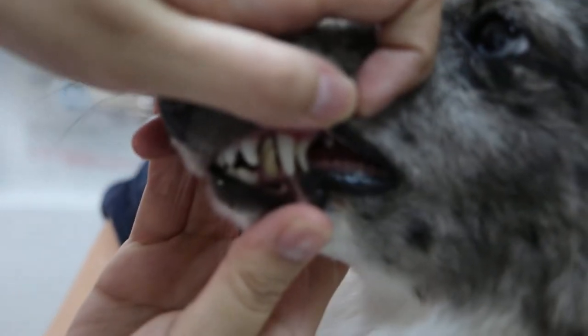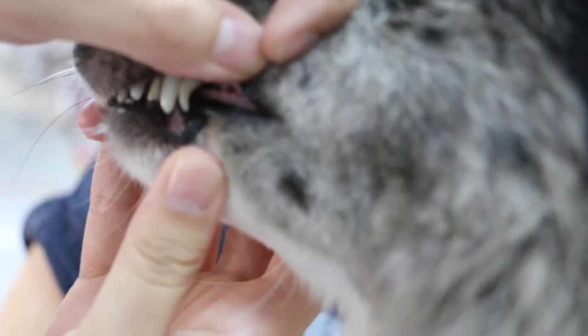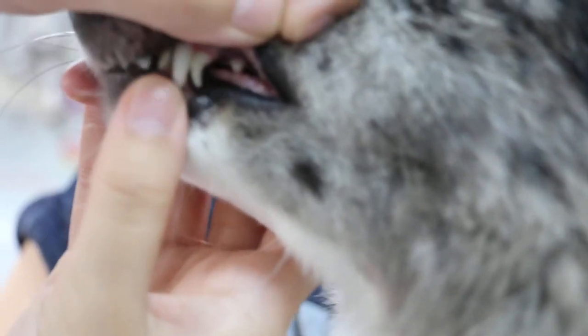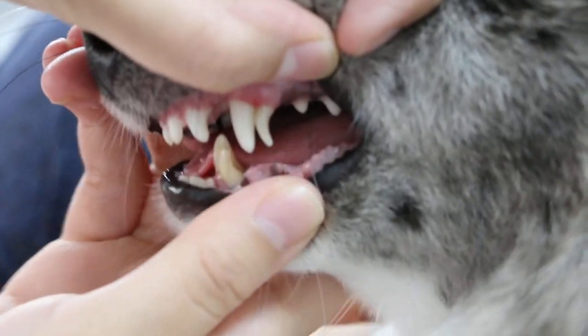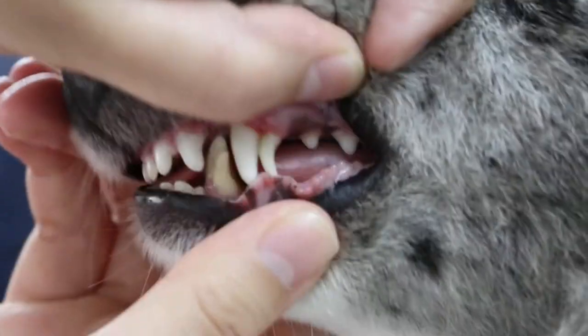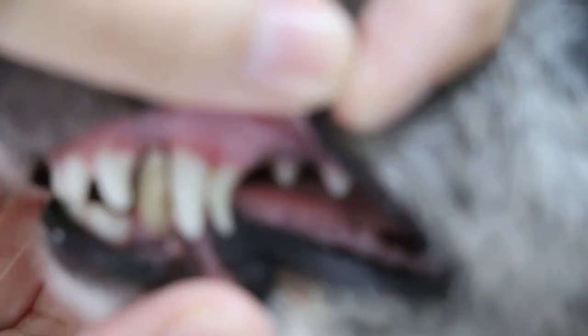Okay, so this is the left side — the canine tooth. The sharp thin one is the puppy one, upper, and the lower lip — lower. You can see the thin one in front of the lower canine. That means the permanent one and the puppy one are both there, so it's advisable to remove the puppy one. They should drop out at six months of age, but they didn't.